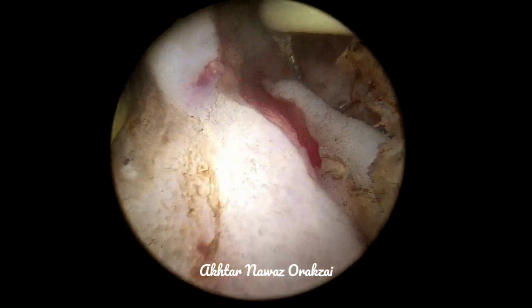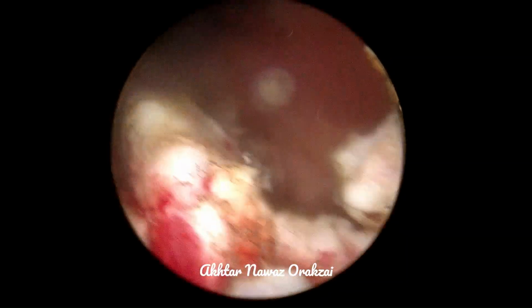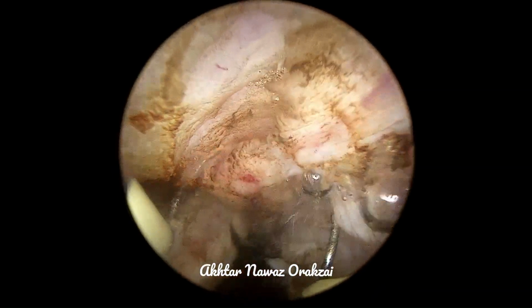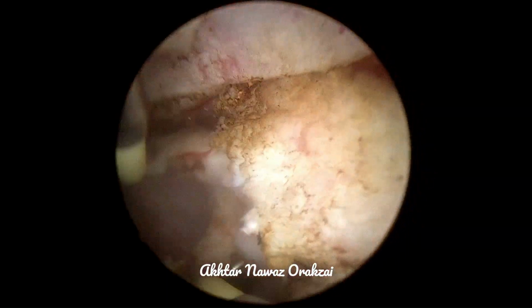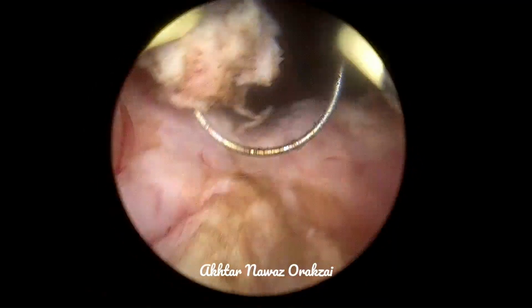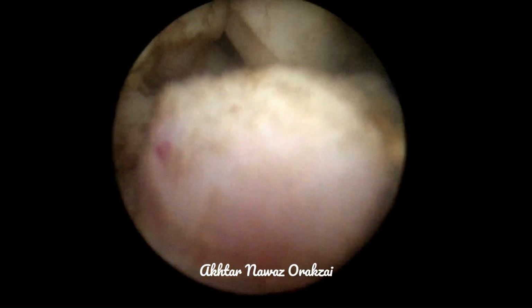Number two is that post-operatively, the patient will be having more irritative lower urinary tract symptoms in the form of frequency, urgency, and especially extremes of pain during micturition. All these are signs of a breach in the capsule. So it is an unwanted thing to happen. However, it may happen, so one must be able to deal with the situation.